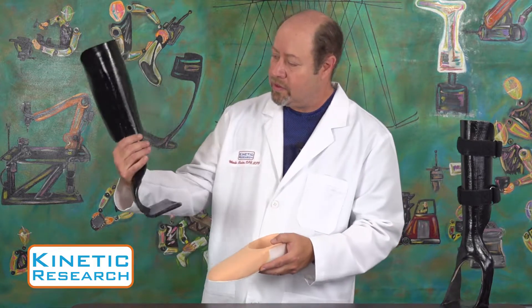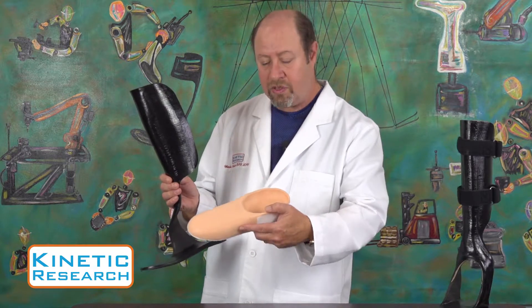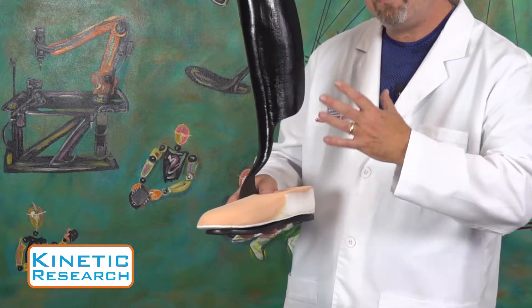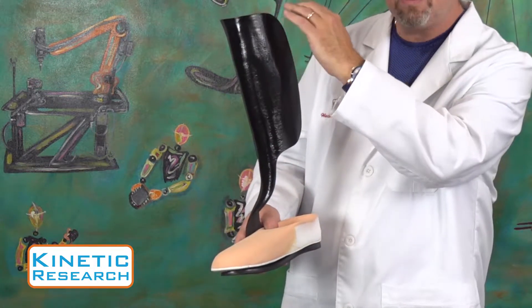It comes with the composite shell and foot plate as well as the custom insole which is added to it. This requires a practitioner to cast all the way to the tibial tubercle.